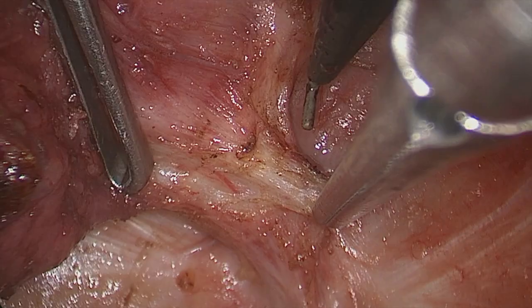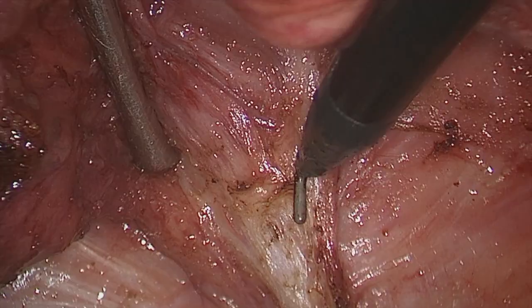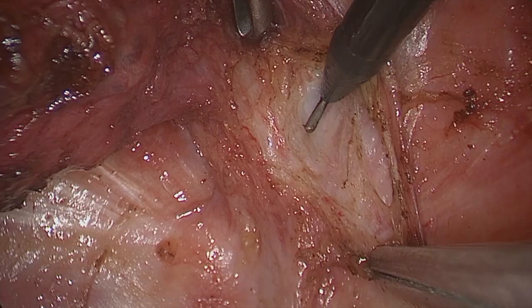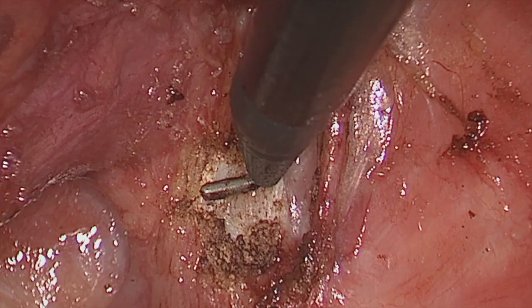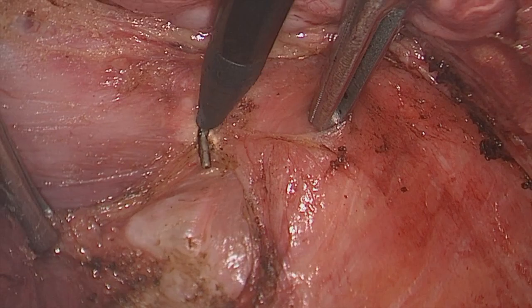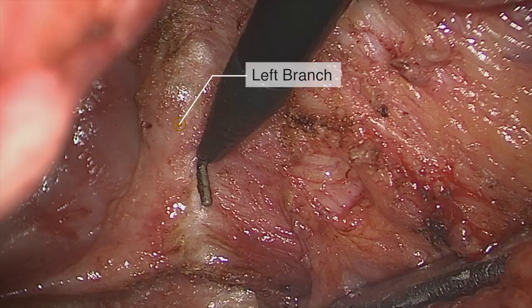Coordinating traction and countertraction movements to maintain exposure. The rectum and the levator ani are dissociated along the inner lining of the hiatal ligament. Then, the intersphincteric space is identified. Continuing on to the left side.